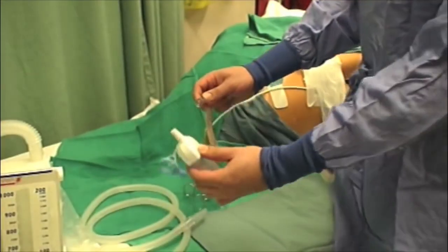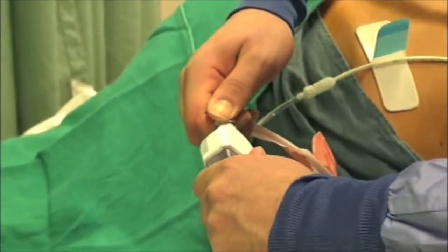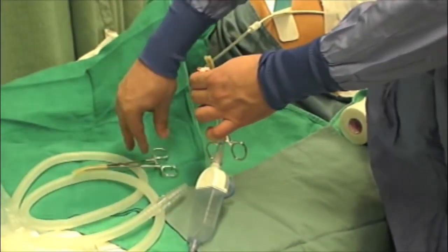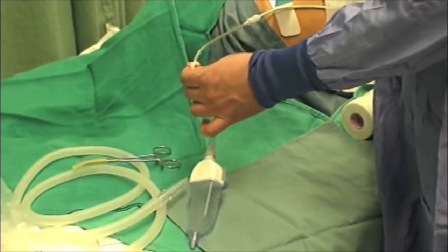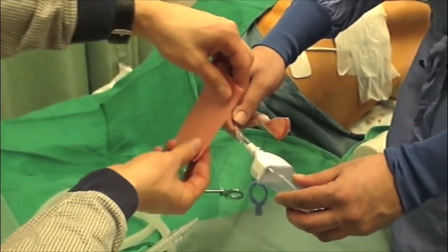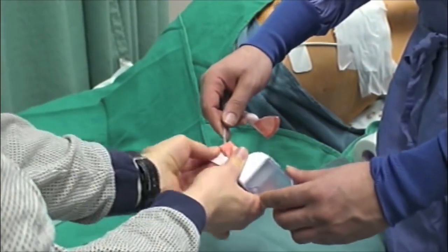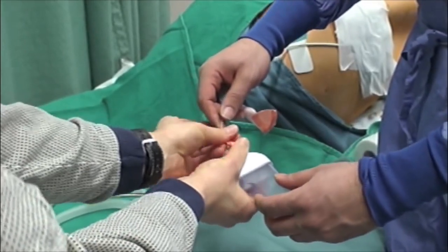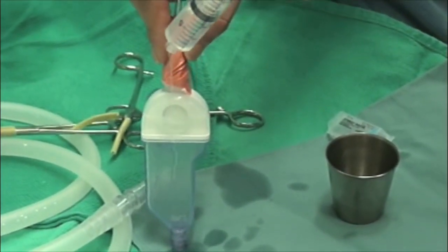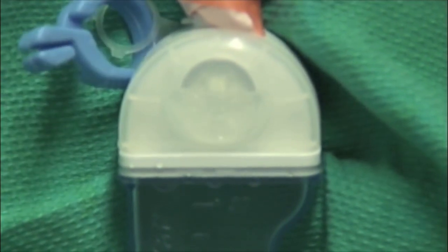Attach the pneumostat. Remove clamps. Apply waterproof tape to the connection. Place a few drops of fluid in the bubble chamber of the pneumostat. Ask the patient to cough and observe for air bubbles.